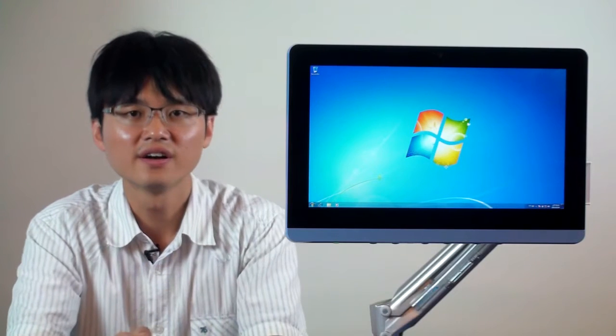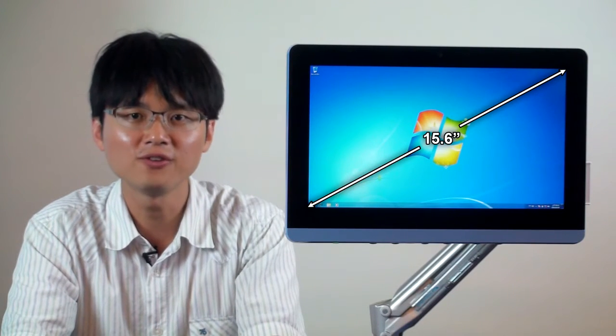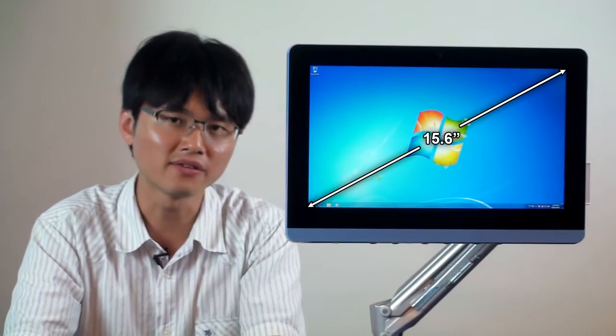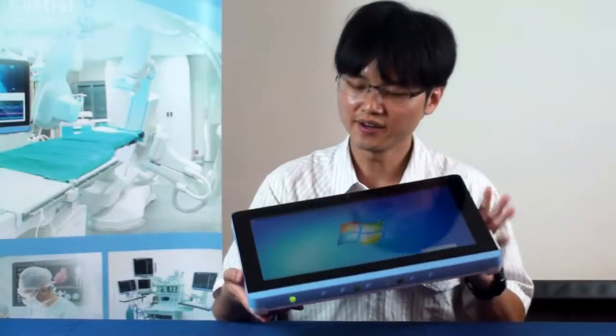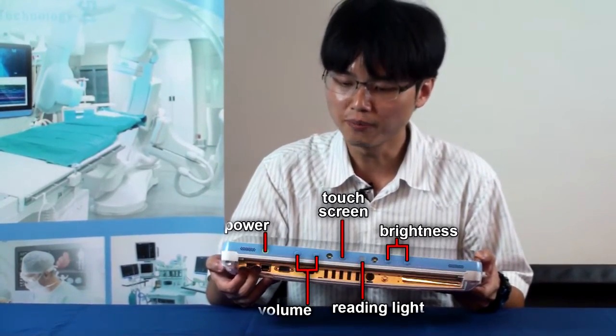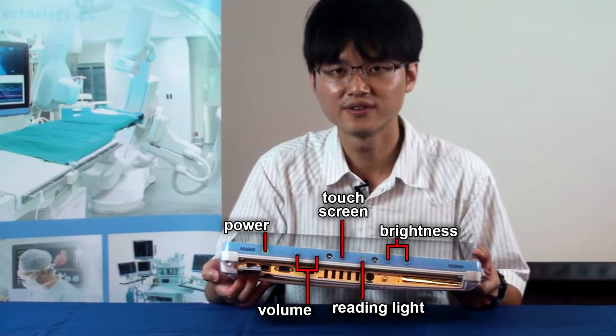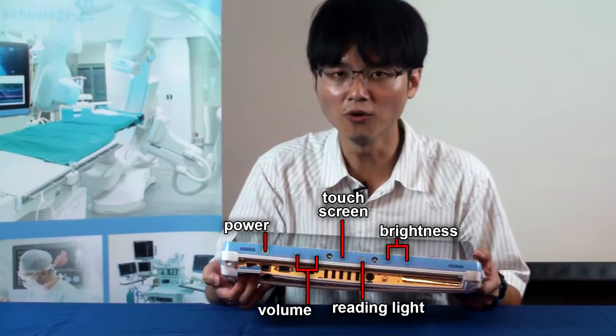On the front side, it's a 15.6-inch edge-to-edge bezel design. On the bottom, you can see several functions here. You can control the power, LCD brightness, volume adjustment, reading light, and touch on and off.